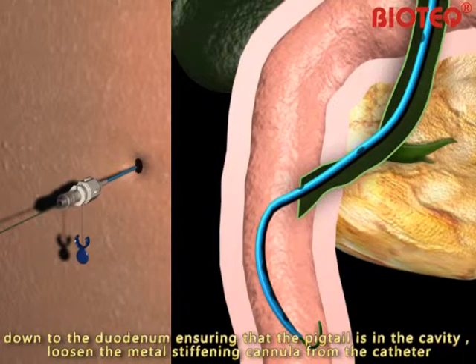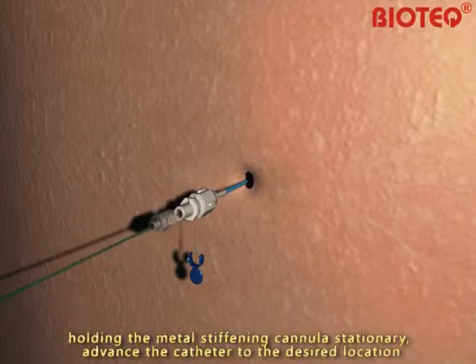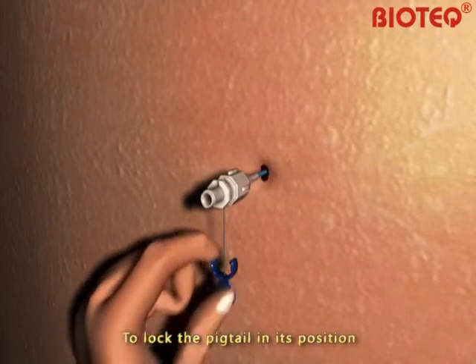Loosen the metal stiffening cannula from the catheter while holding the metal stiffening cannula stationary. Advance the catheter to the desired location. Remove the 0.035-inch guide wire, then remove the metal stiffening cannula.